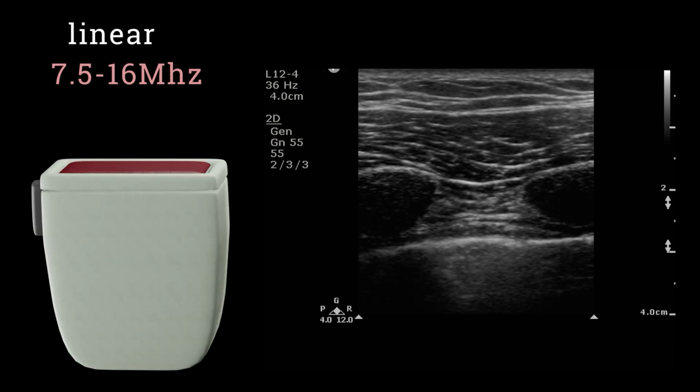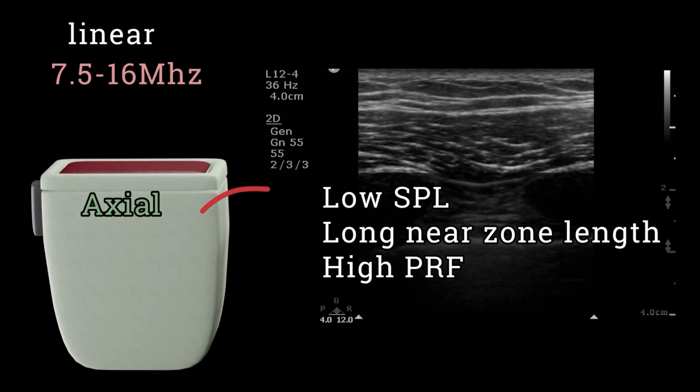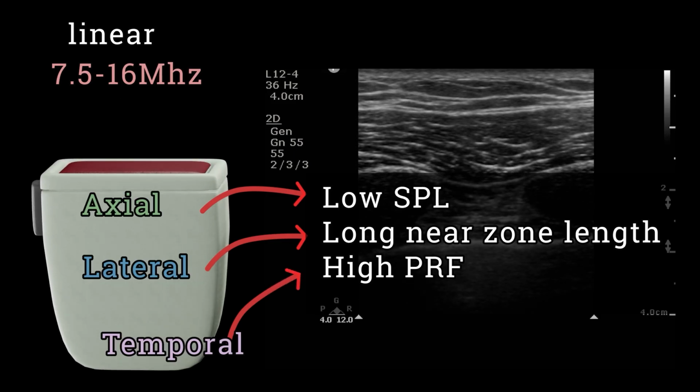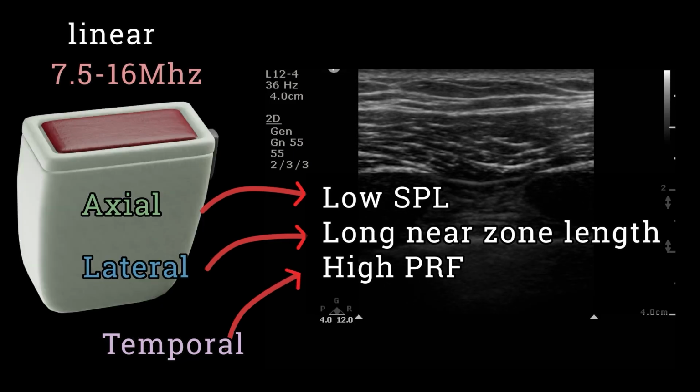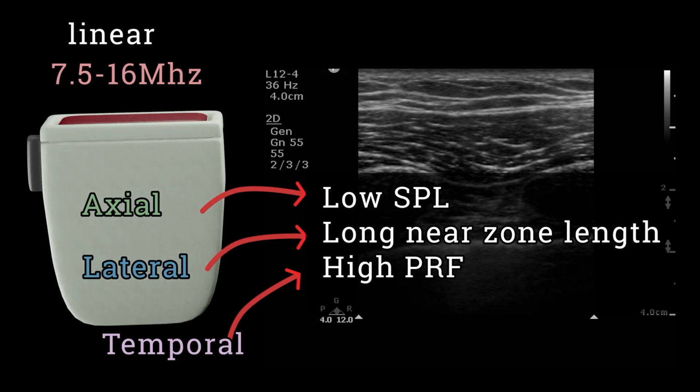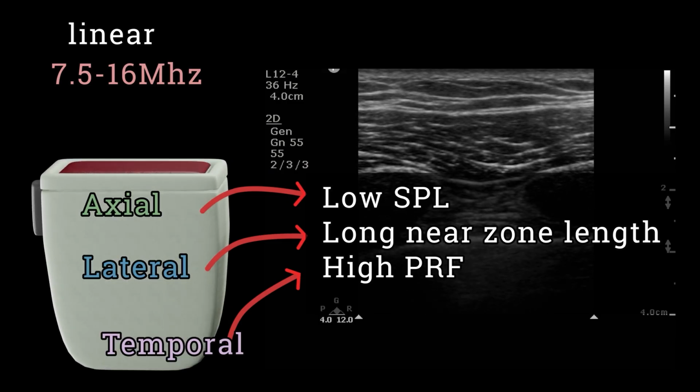This allows it to have great spatial resolution since both axial and lateral resolutions are going to be high. The drawback is that these suffer significant attenuation, as we shall see in just a second. This means that we cannot see very deep. We will be using this probe when assessing the lung and in vascular ultrasound.